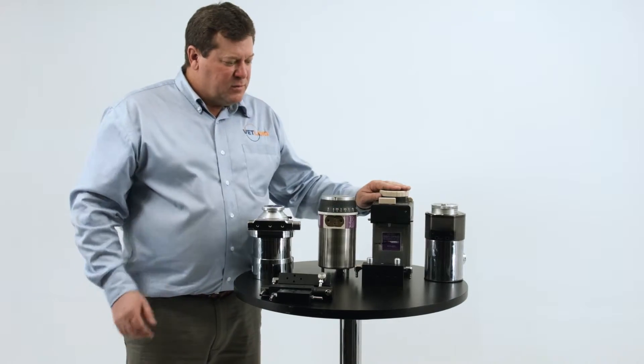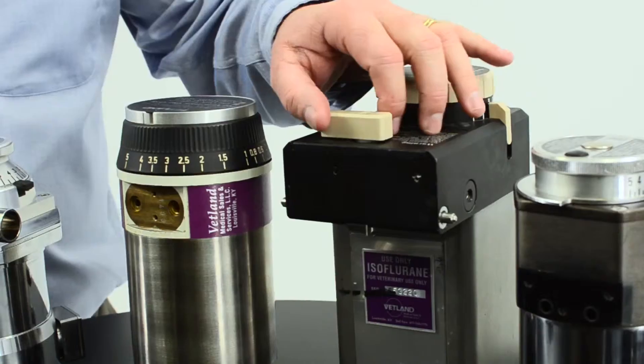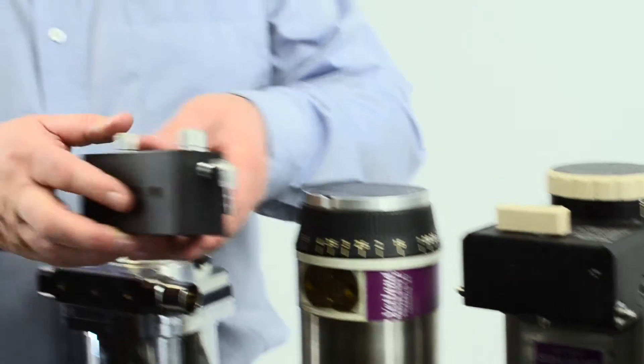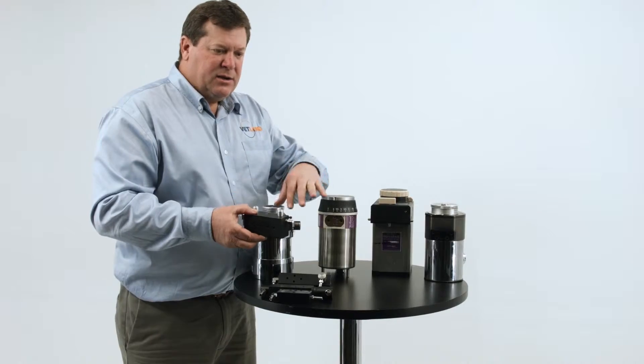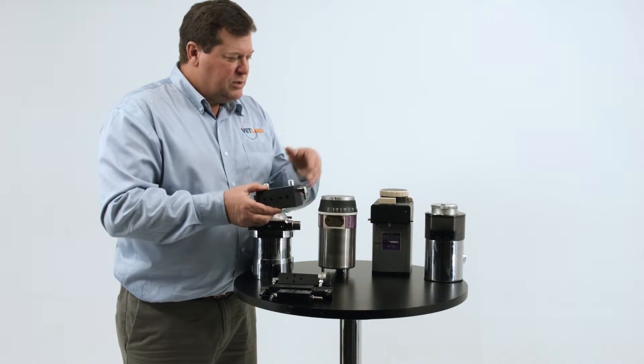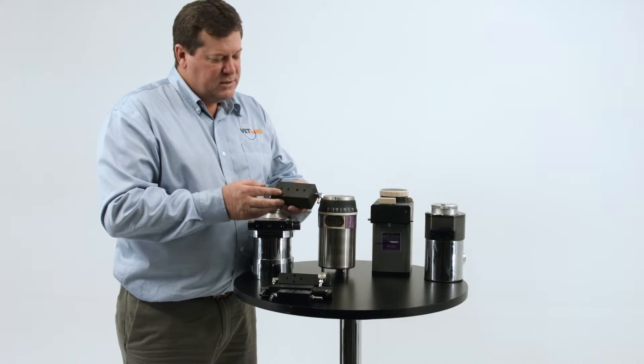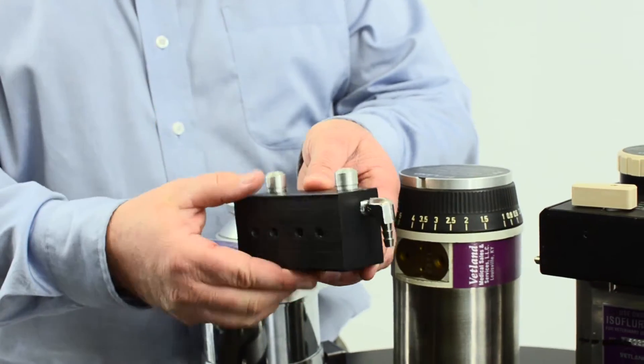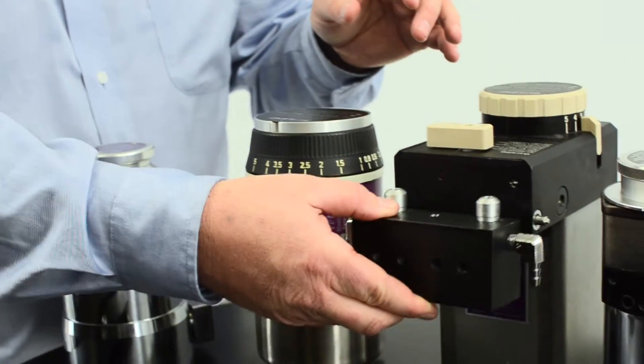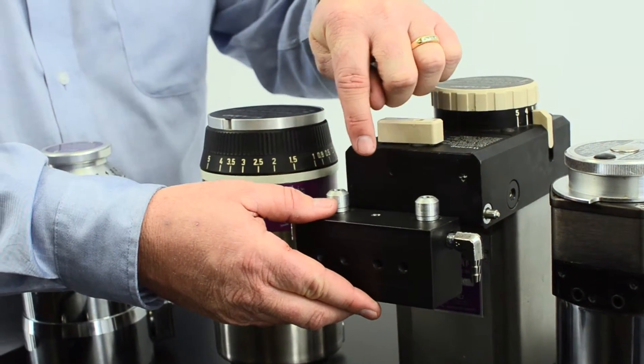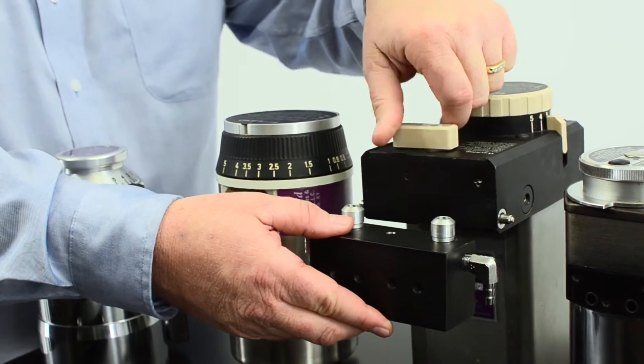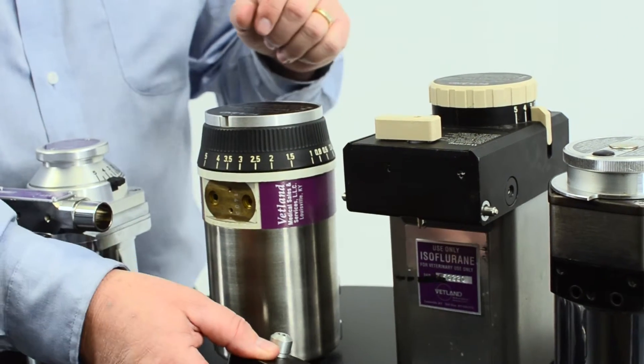On the TEC-4 vaporizer, because it's a latching vaporizer made to be interchanged, taken off easily and changed from one drug to another. For instance, you have a block like this with two posts that the vaporizer sits on and it can either be bolted in place or it can be latched in place. This is the TEC-4 manifold.